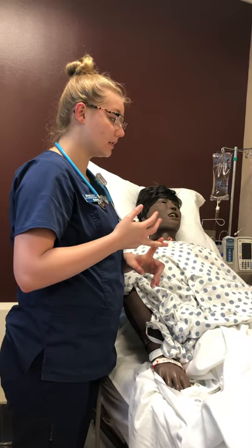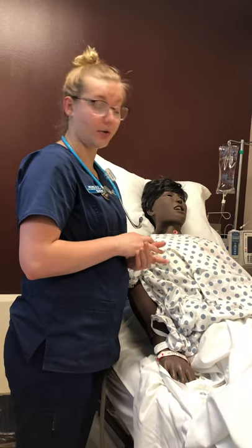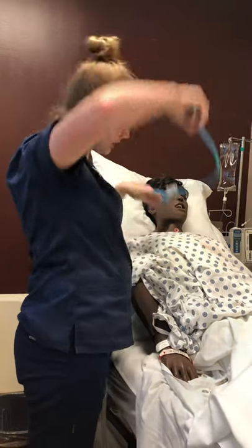Especially in adults — if it's in children under the age of two, that is normal. So we're just going to have a quick listen here.